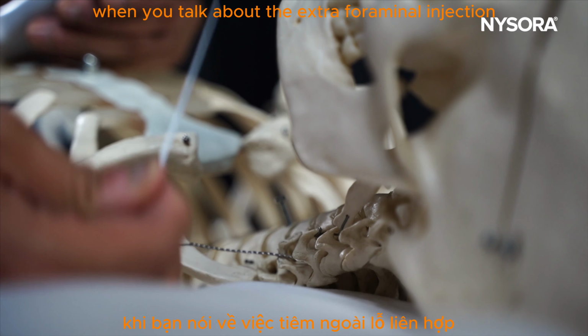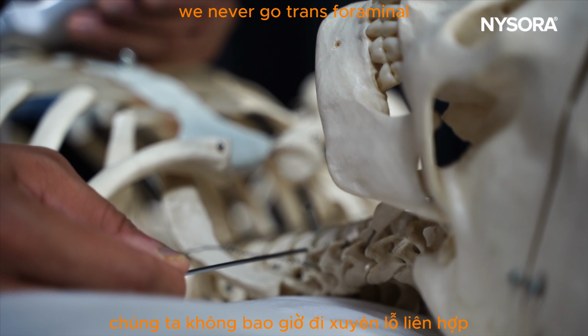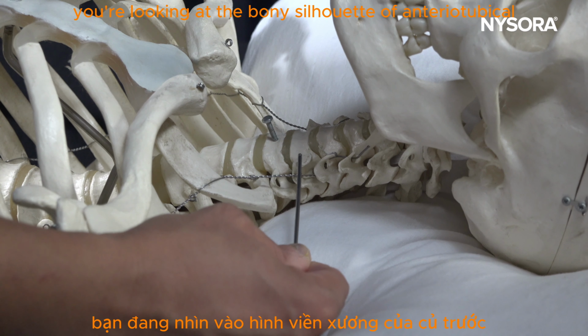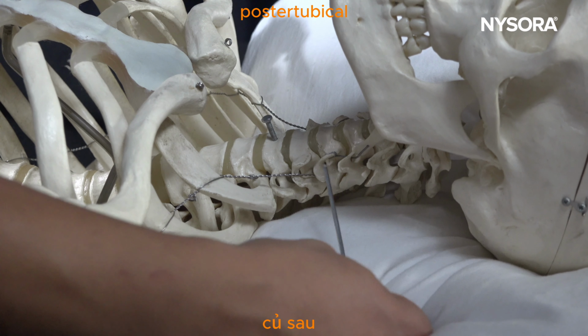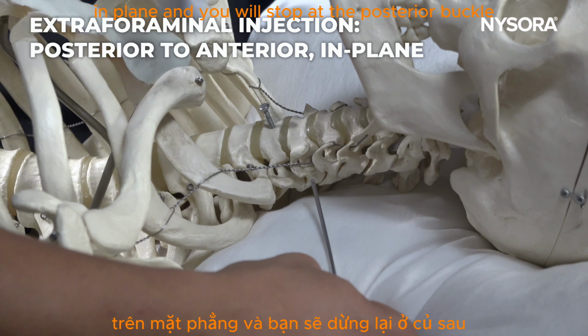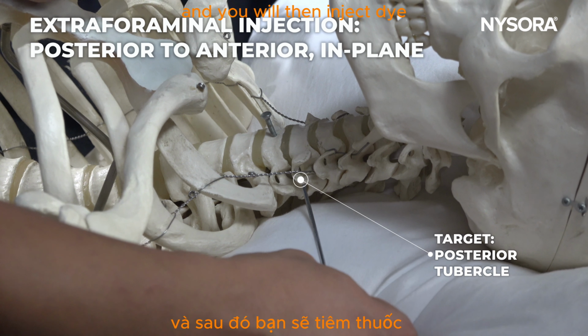When you talk about the extraforaminal injection, when we use ultrasound, we never go transforaminal because you're not going into the foramen. You're looking at the bony silhouette of the anterior tubercle and posterior tubercle, and you bring the needle from posterior to anterior in plane, and you will stop at the posterior tubercle, and you will then inject dye.